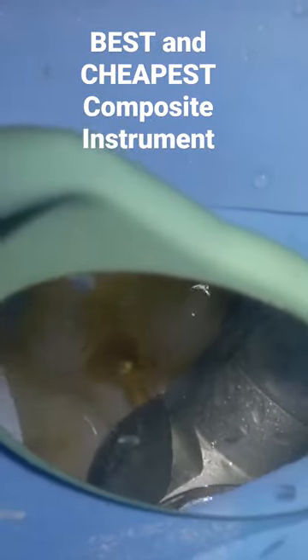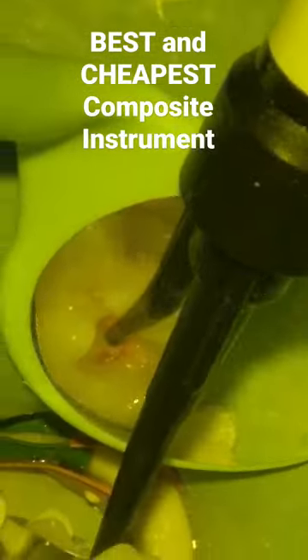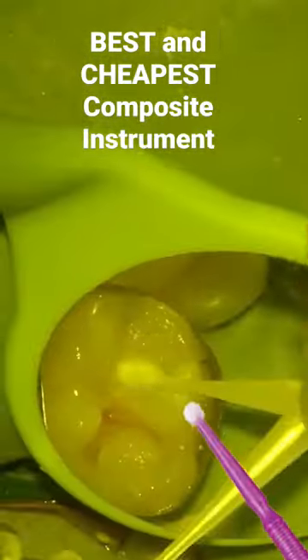In this video, I want to share my favorite technique for handling composite when doing posterior composites. So many of you have these fancy instruments, but what I find so simple and easy to use is a probe and a micro brush. With a micro brush, I'm able to adapt the composite and get the morphology I want without it sticking to my instrument.